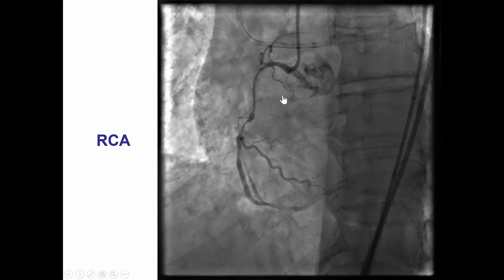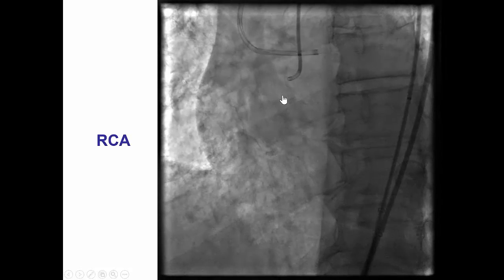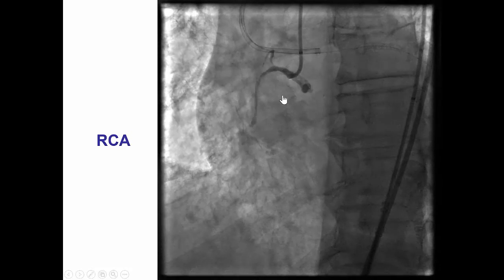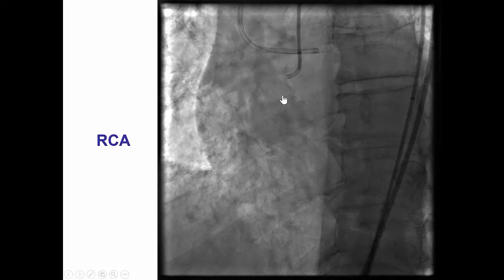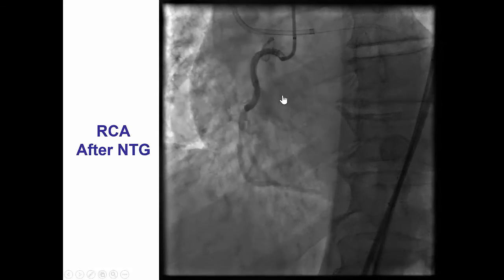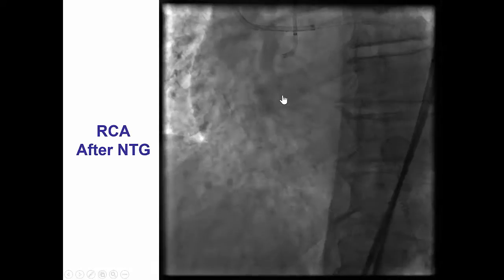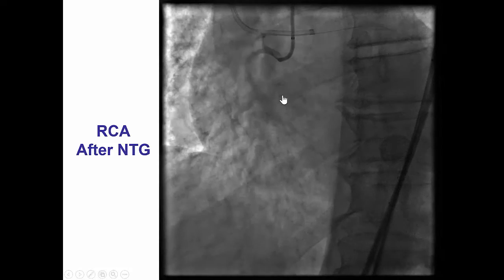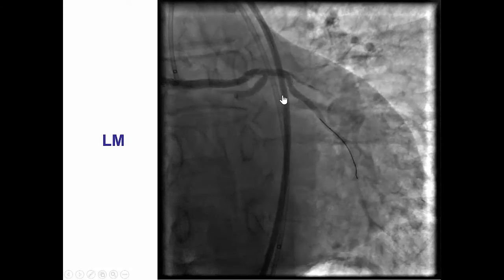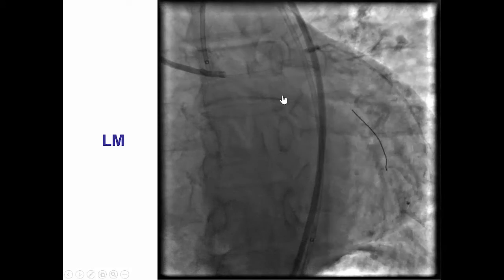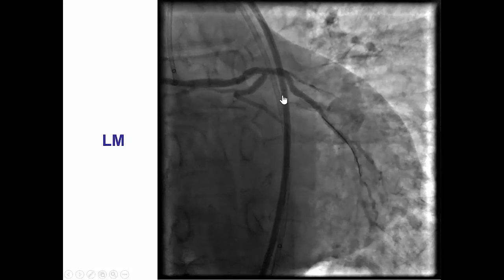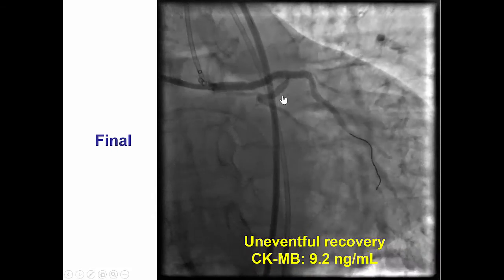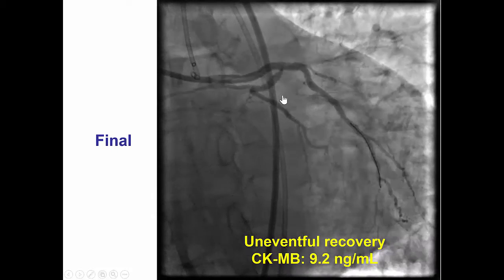The patient received some vasopressors. During that, there were some changes in the coronary artery making us wonder whether we could have caused some injury during the retrograde wire attempts. However, after administration of a small dose of nitroglycerin, there was resolution of the spasm. It was all spasm causing the diffuse apparent coronary disease. The patient did have good flow. There was still some dissection that required placement of an additional stent, but the patient did have an uneventful recovery.